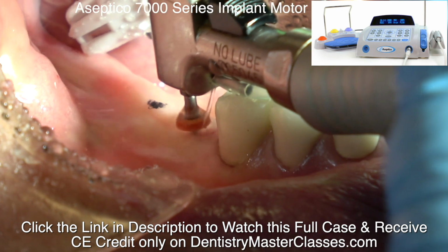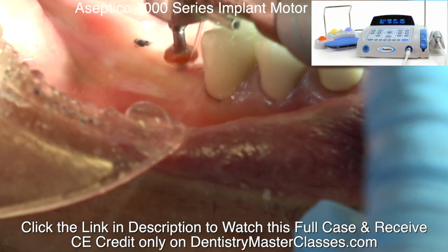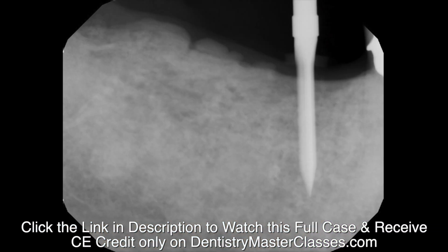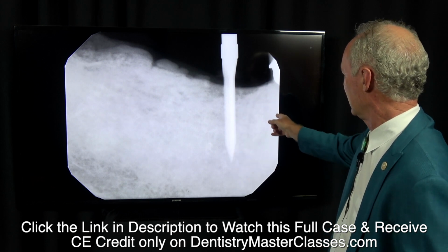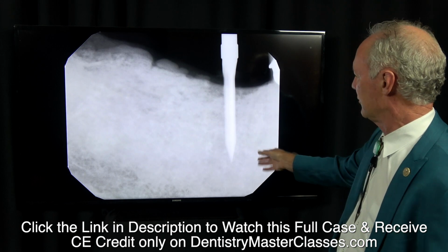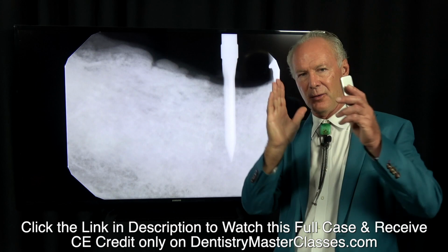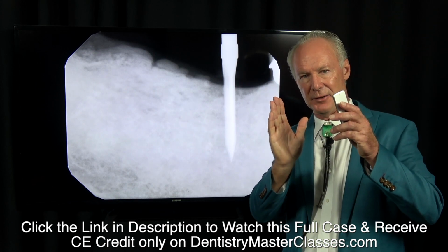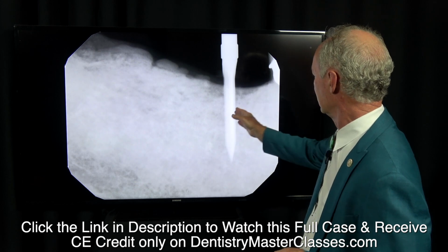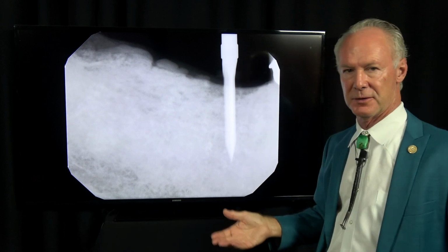So you want this endostop to be stable. I'm going to drill, and I want the tooth in front of it to see that this implant is approximately parallel to the tooth in front. Now when I place both these implants, you'll see that they're not quite parallel to each other. They're close, and this implant is a little distal to this tooth than ideal, but it works really well.